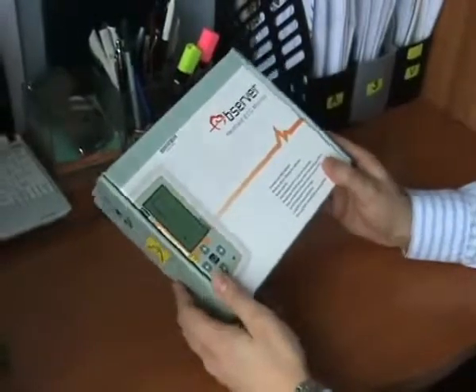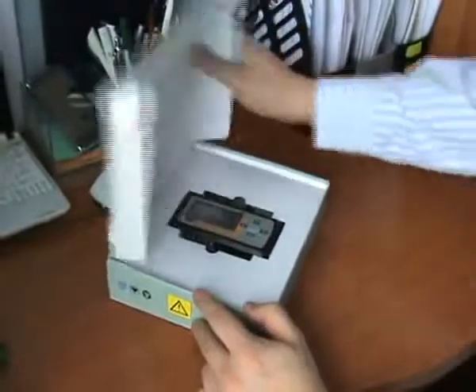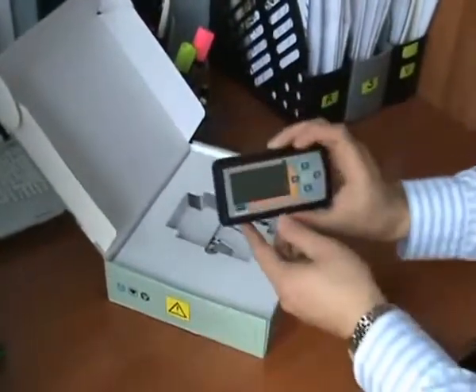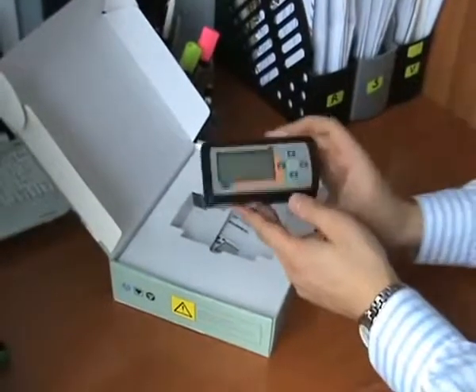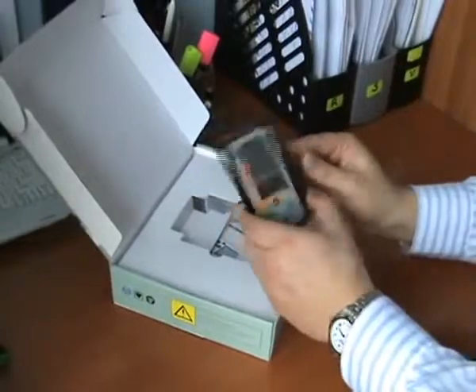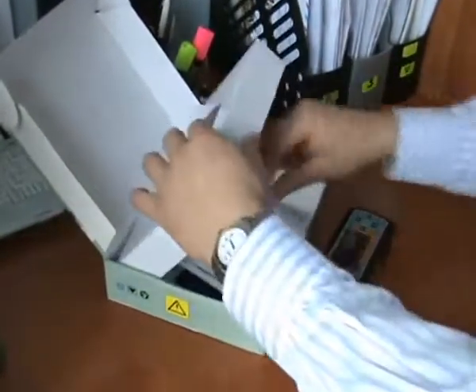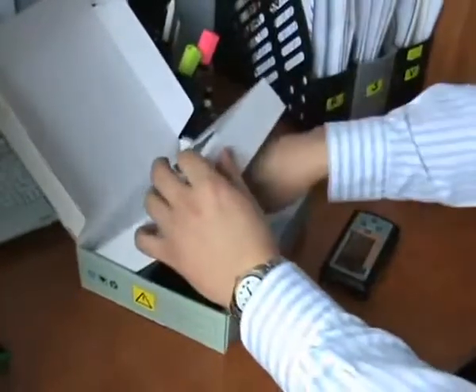Hello, I will present a handheld one-channel ECG monitor produced by ChoiceMath. This model is AMD100A, a very accurate and compact device.